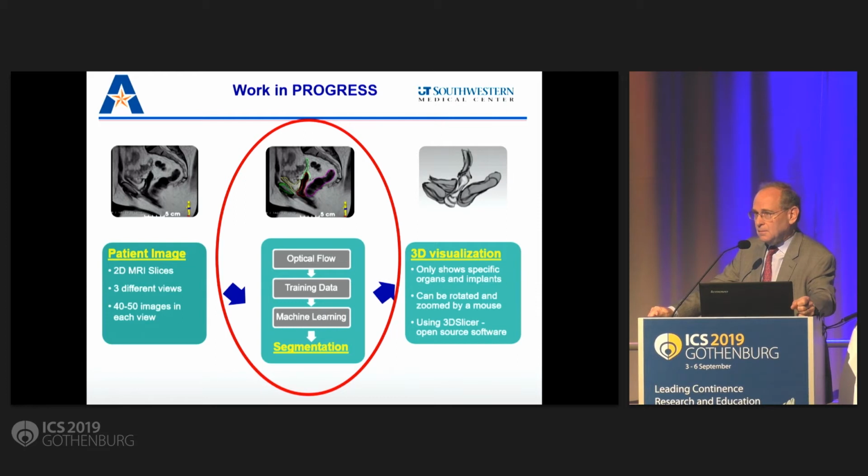Very interesting. So you think, because I think that it's not only for taking out some mesh, it could also be how meshes change the physiology of the area? Totally agree. Right now the focus is on trying to help with guiding surgeons ahead of a reoperation. But you're totally right. We don't really know what happened to mesh in the body. So we don't have the opportunity right now to re-image a lot of patients, figure that out.